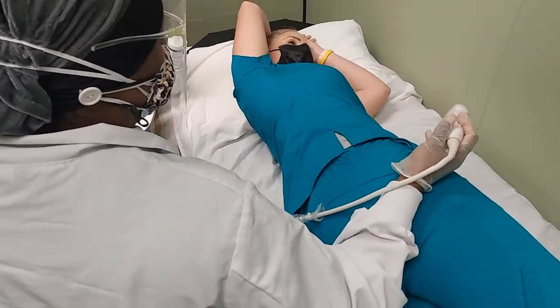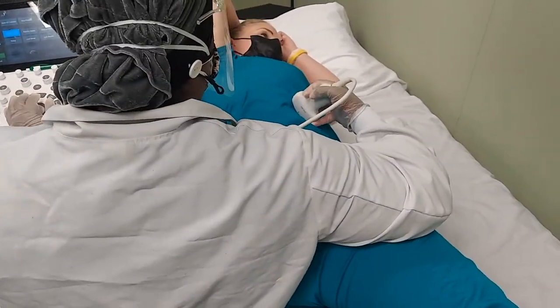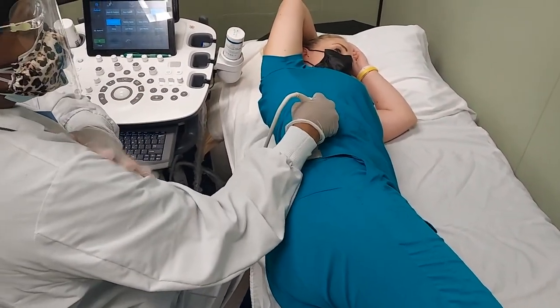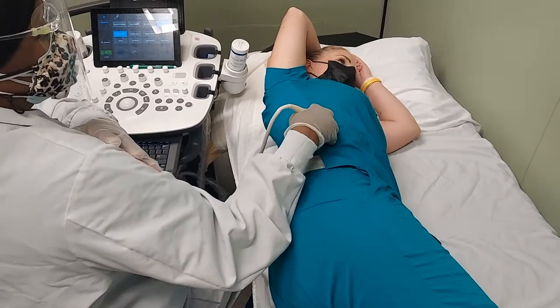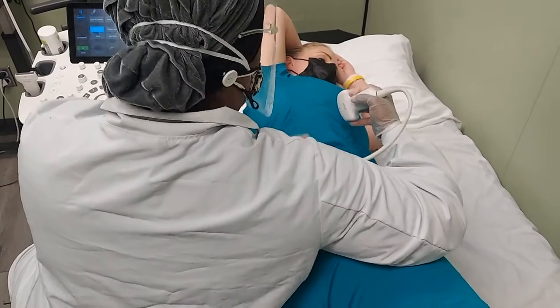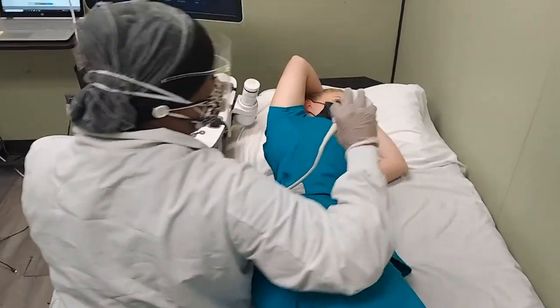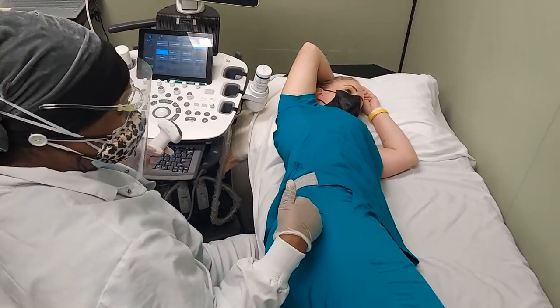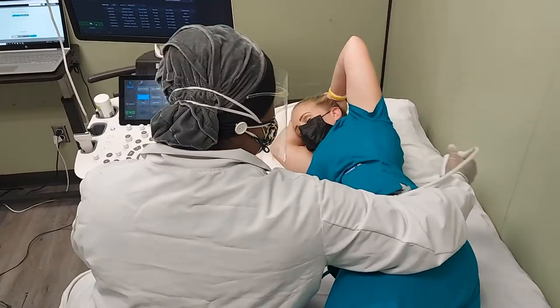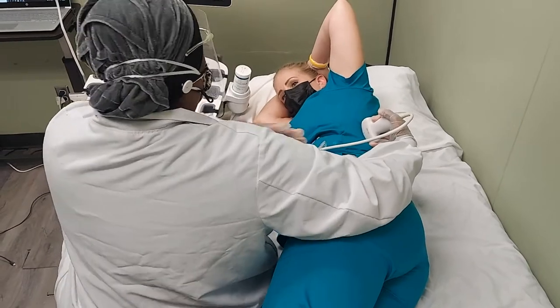When you have your patient go in the lateral decubitus, have them slide their hips and butt back towards you and actually hug the patient — as I was doing previous to this image here — instead of scanning away from your patient where your shoulder is working more. See my position here: I'm able to get in the midline, also scan the right side, and I'm resting my arm on the patient.